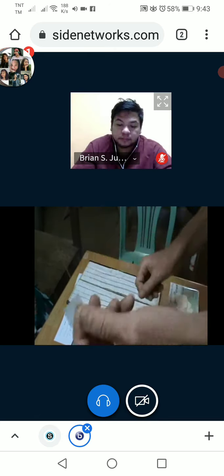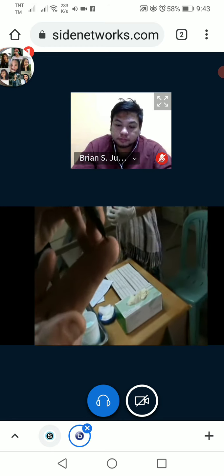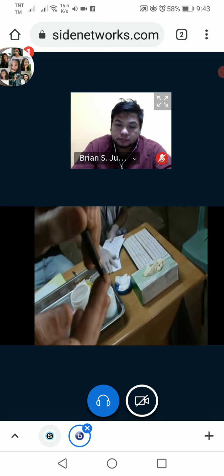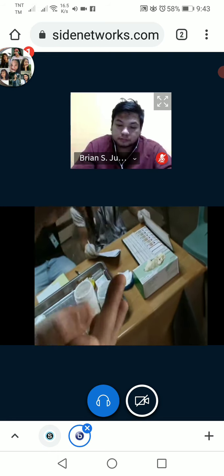Health worker should be comfortably seated with enough bench space and proper lighting. For pricking the finger, choose the middle or the ring finger. Always prick on either side of the fingertip, not in the middle. This is because the middle of the fingertip has more nerve endings than the sides. Therefore, pricking on the side is less painful for the patient.